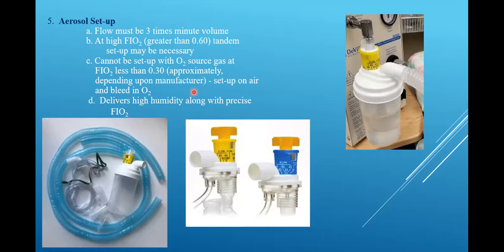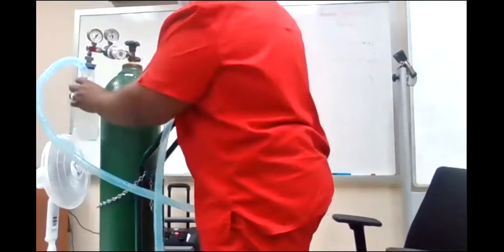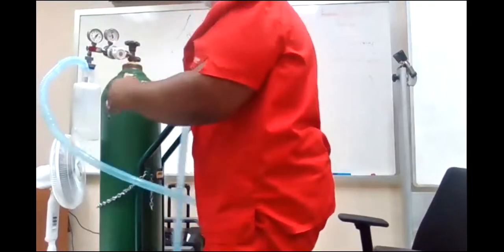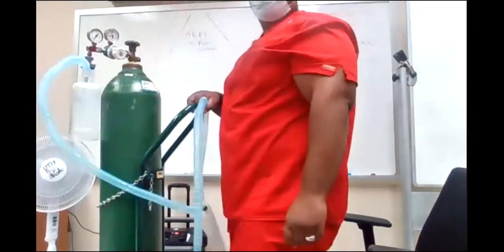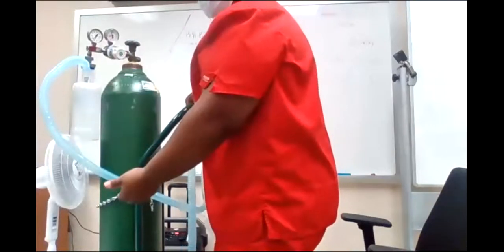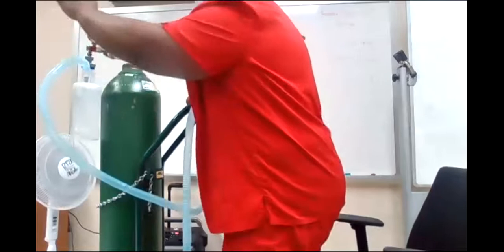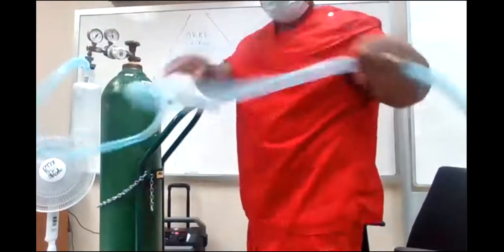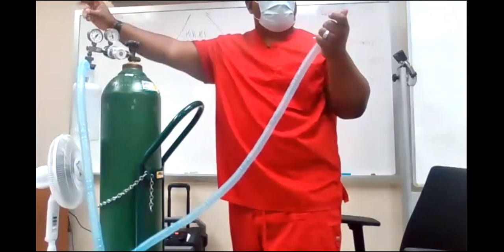If I have this set up like this, guys, and this is hooked up to oxygen. Now, if this didn't have a Venturi setup and there's pure oxygen coming through, but I wanted to blend it down, then this would have a little side port here, and that would hook up to an air flow meter. That's only if it didn't have the Venturi. If it doesn't have a Venturi system, then this is 100%. So if I want to bleed that 100% down, it'll have a little side port here, and that little side port will hook up to an airflow meter. And then I would put my oxygen analyzer on the end right here and measure it. It'll just read, let's say, 100% on my little machine. And then I would turn the air on, little by little.